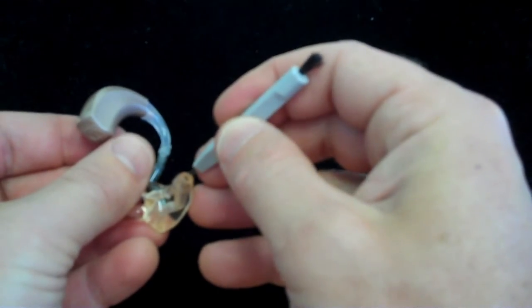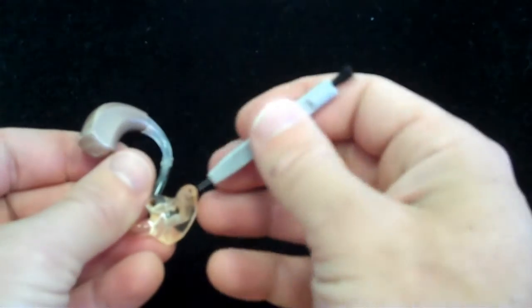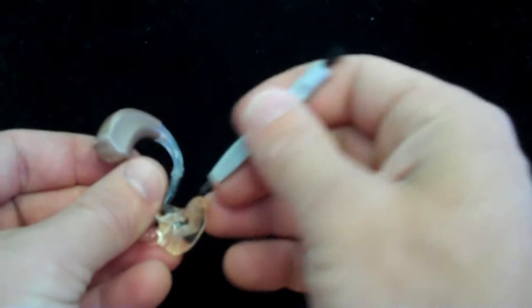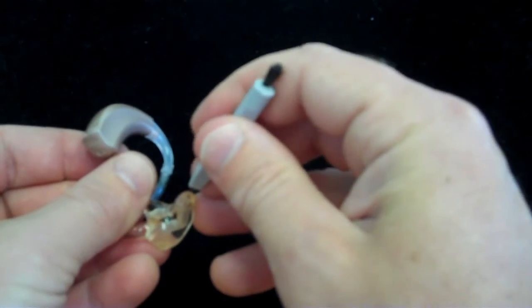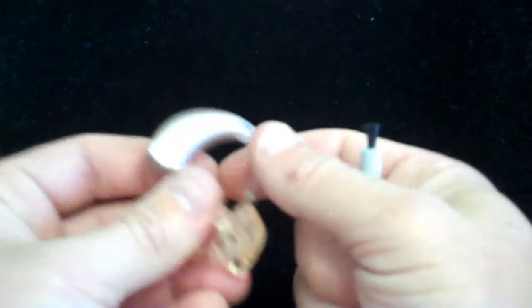Now, the one benefit to a behind-the-ear hearing aid is that the ear mold does not contain any electronics, so typically they're not very fragile, so you can just go for it there and not worry about damaging anything. So we're going to clean out both the air passageway and the receiver tube.